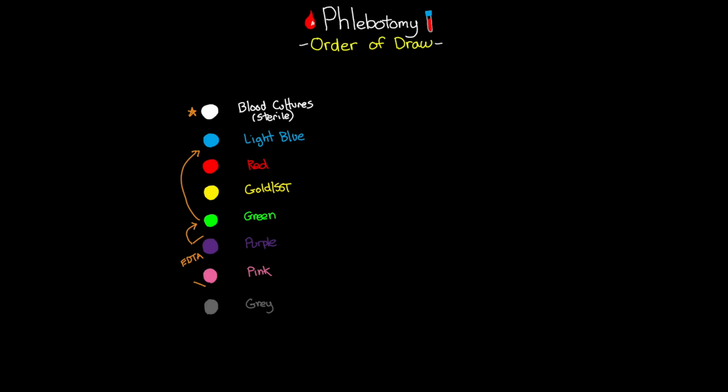So again, like I said at the very beginning, it's absolutely vital that you draw these in the proper order. And so it's important that you memorize this order and be able to draw it quickly without having to think about it. So like I said, I'm going to give you a quick little acronym that hopefully will help you remember the proper order in which to draw these.